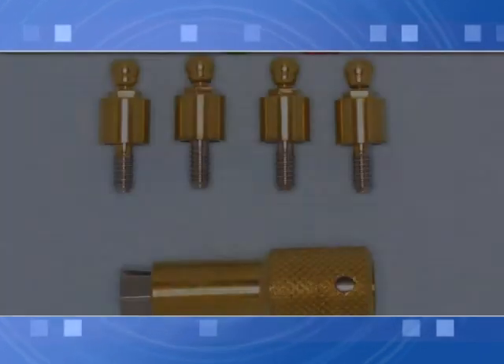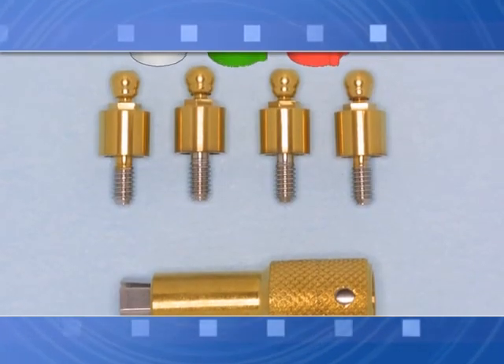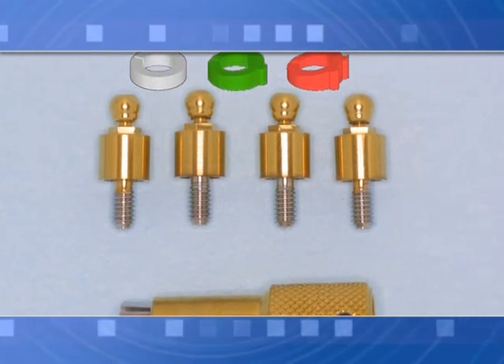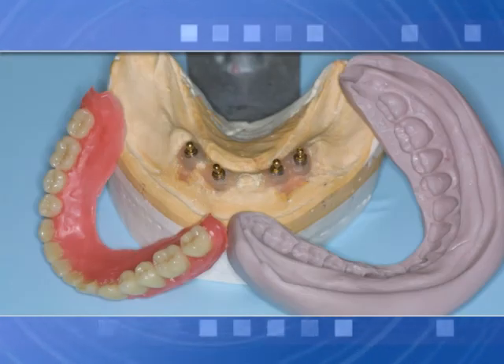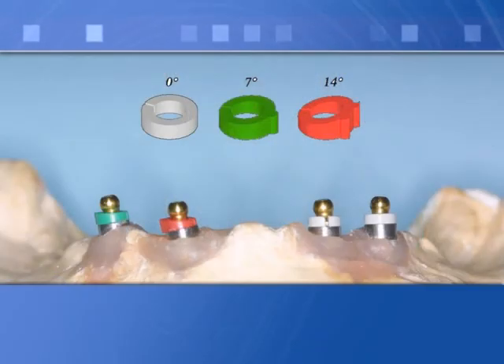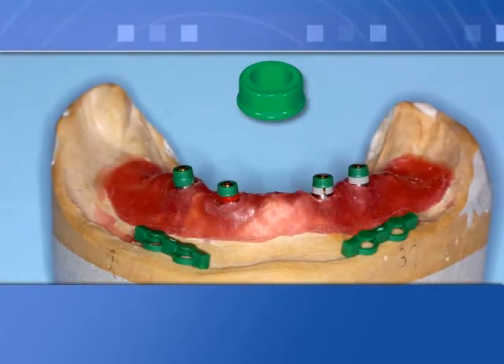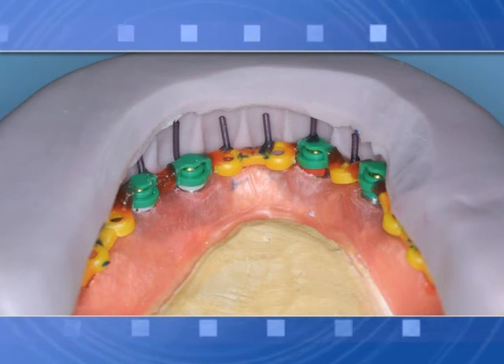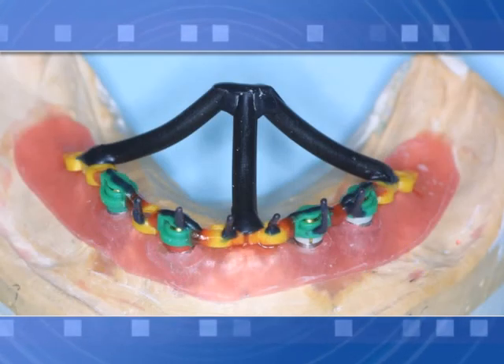Finished denture. Lab procedures: after the waxed denture mount has been tried in the patient's mouth, make a trial mask on the model to check spaces available to work. Using OT box castable components assembled together, it's possible to create cast reinforcements directly on master models without the need for investment duplication. The trial mask helps to fix rotative pins in proximity of frontal teeth.